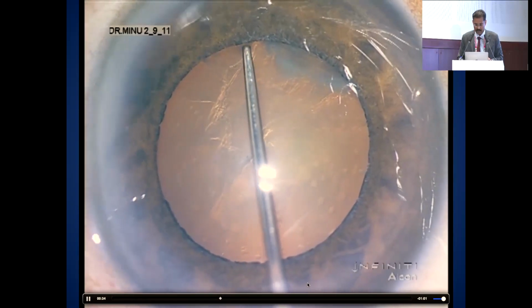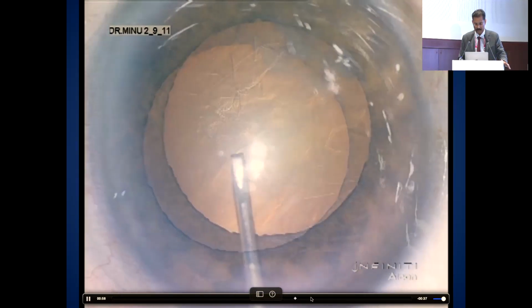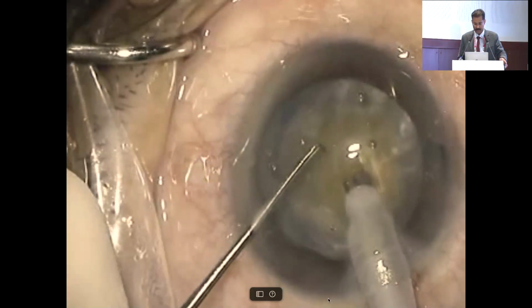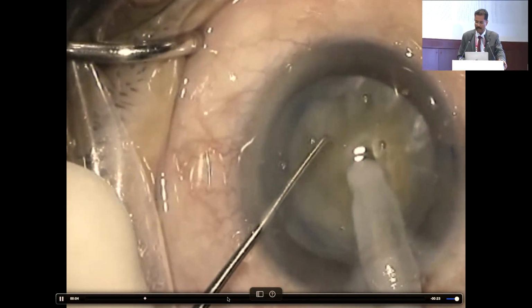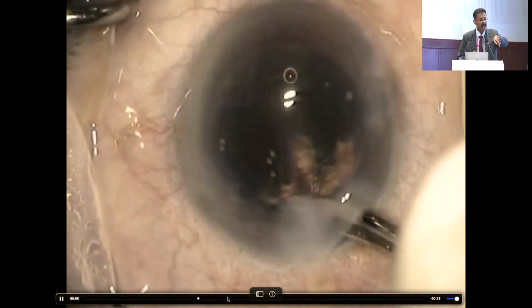I am trying to bunch it up and take it up. Beyond that, you can just see the whole thing is being bunched up now. And then the capsular rhexis is started separately on the capsule and finished. So just to show you that even if you think that your manual rhexis is quite good, be gentle with your anterior capsule and your rhexis margins.